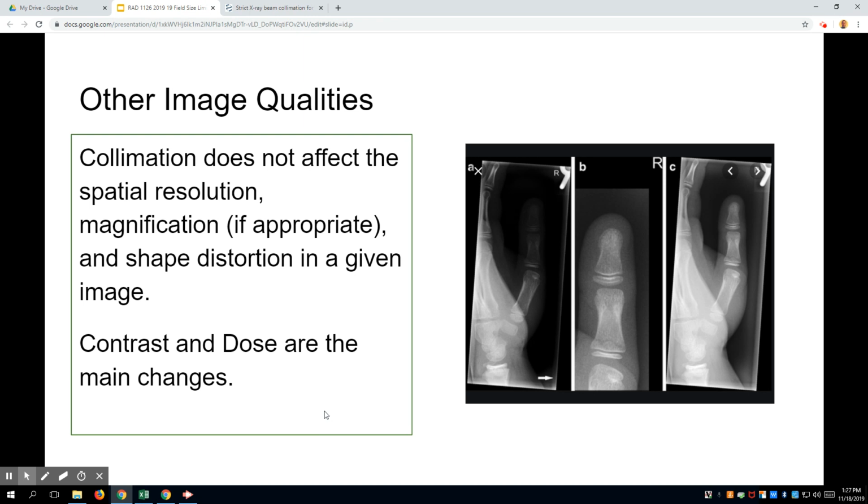I walked out on a temp job once. The collimator light was broken. So I went to the doctor. It wasn't a radiologist, just a doctor that worked in the place. I said, what am I supposed to do here? Just open it up, they told me. Really? Just open it up and kind of use your finger and figure out where it is. I have kids now, so I don't know if my decision would have changed. I didn't need as much money as I might. But in all seriousness, I think I did the right thing. The temp agency was cool with it. My employer, who wasn't at that actual office, was okay with me walking out, because you don't just leave it open. That is unethical.